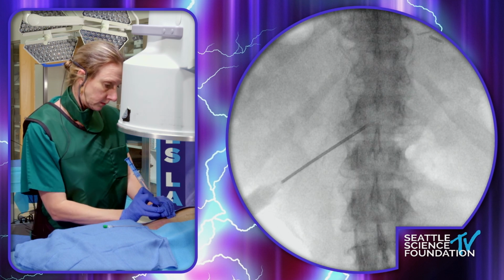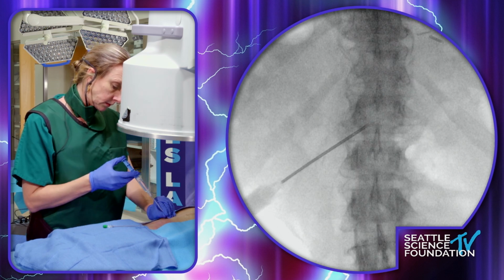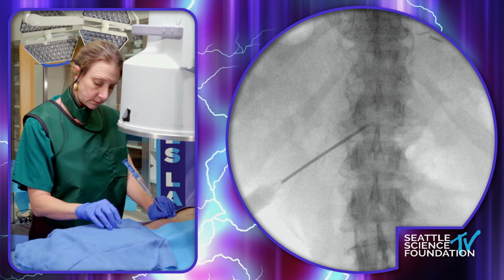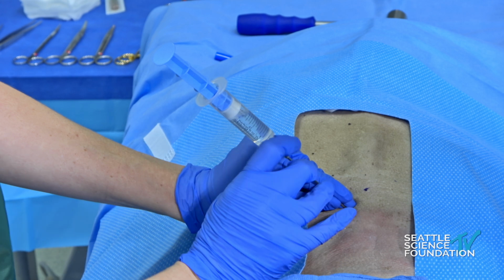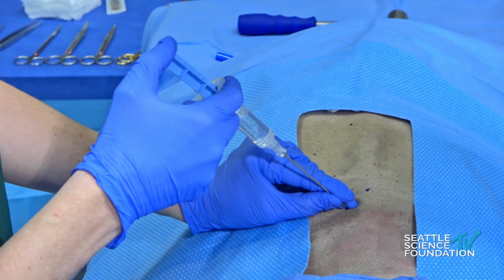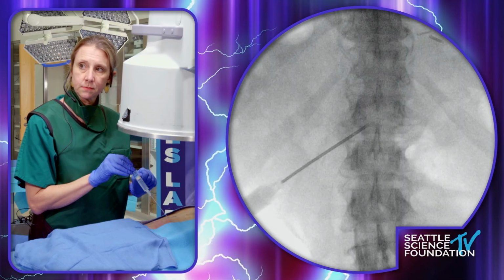Good. So as long as you're overlying the lamina, you can go down, use the lamina as a depth mark, angle superior and dorsal.